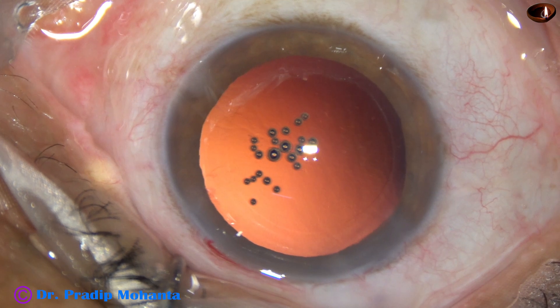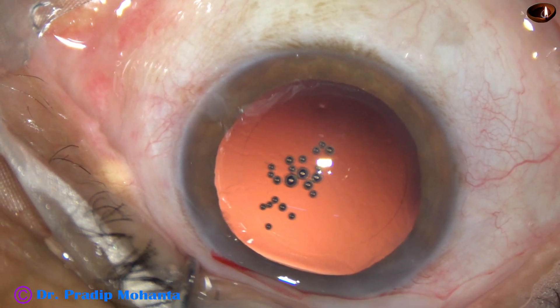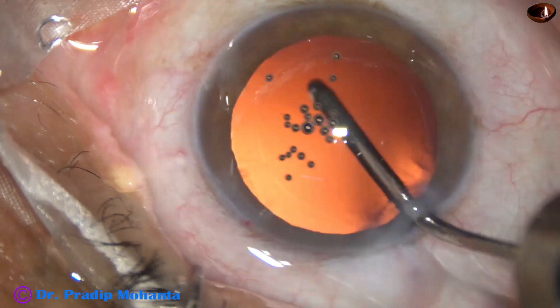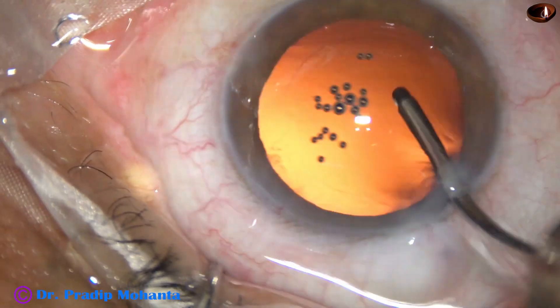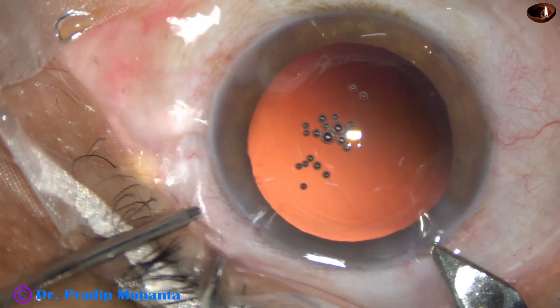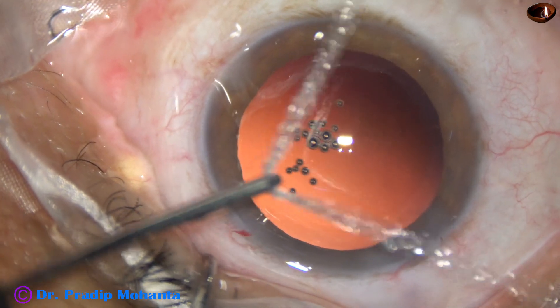Now is the time to implant an intraocular lens. I am going to use a B-cartridge, so I need to enlarge the main wound a bit. Before that, this is hydro-polishing — polishing of the posterior capsule with just irrigation. The irrigating cannula is directed towards the posterior capsule and swept from one side to the other.